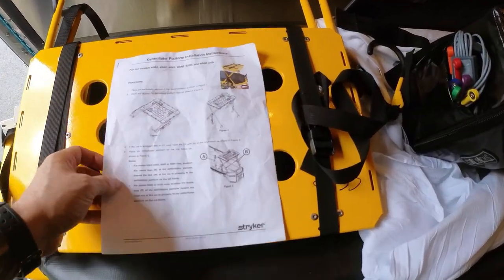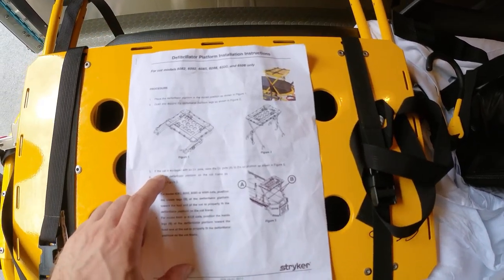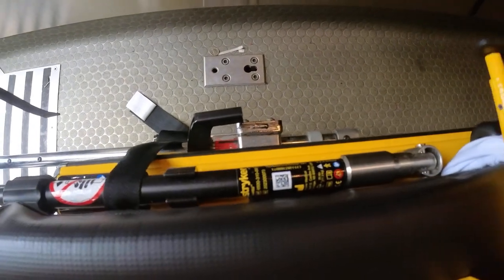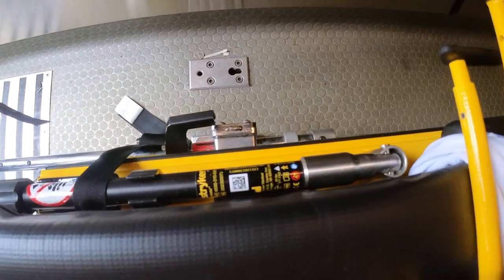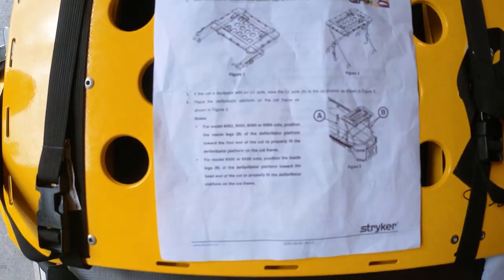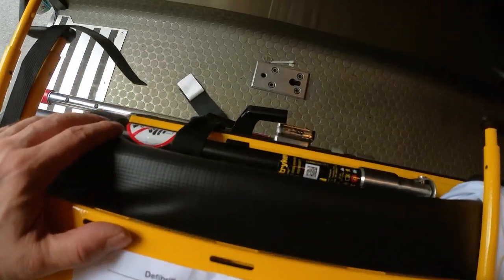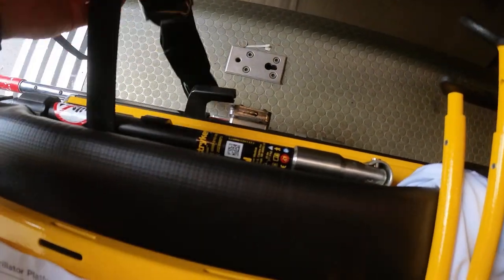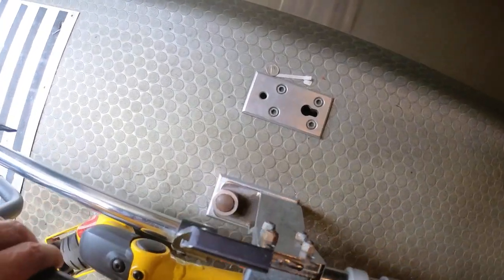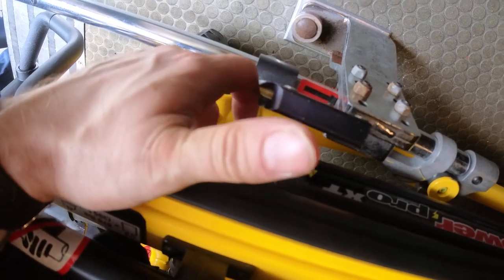A couple of very important features: when we're going to secure this device, the IV pole has to be brought up — you cannot secure this device with the IV pole laying down. Also, we have an electric stretcher, and the hooks of this device are going to go essentially underneath this part right here. We'll show you how to mount it — the hooks are what actually secure it in place.